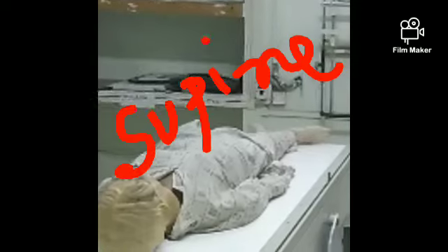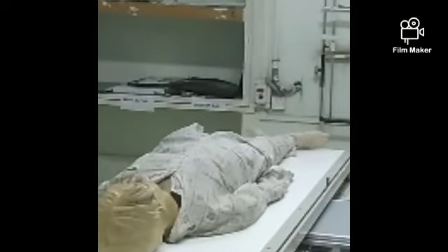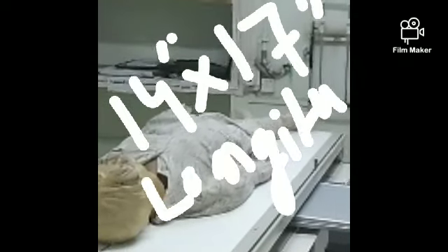Hello my dear students, today we are going to discuss how we will do pelvis AP view. In case of pelvis AP view, the patient will lie down in supine position perpendicular to MSP. Next you are going to select the size of cassette. The cassette size will be 14 into 17 and it will be placed longitudinally.